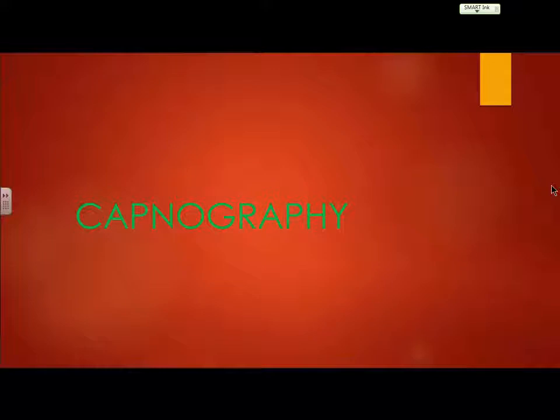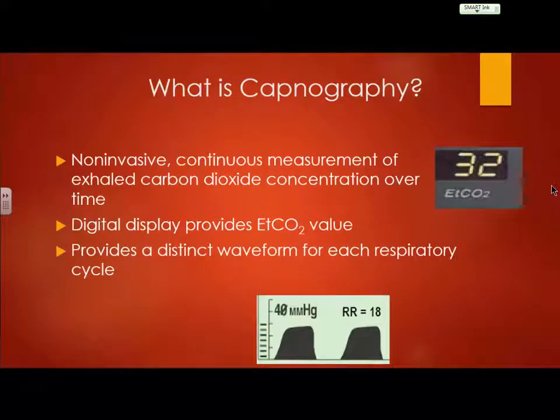So again, I don't want this to be something that is very intimidating to you, because it should not be at all. I feel like it's going to be a pretty easy concept on what we need to know for our standards. So what is capnography? Well, capnography is a non-invasive continuous measurement of exhaled carbon dioxide concentration over time.